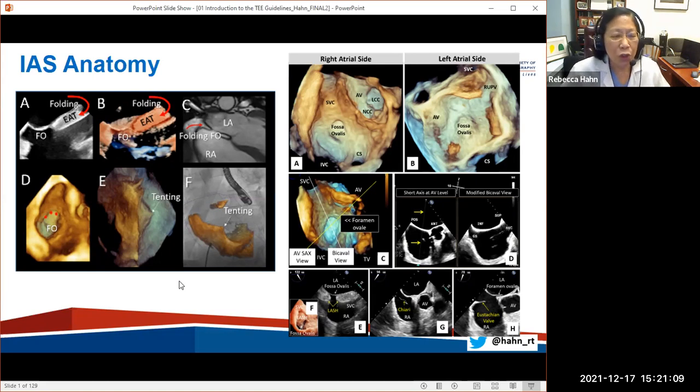often they are not. And so when you do a transseptal through the lipomatous hypertrophy, you risk having gone out the right atrium into the fat, and then back into the left atrium through the left atrial wall, and you won't know it until you take the catheter out, because you're tamponading that space when the catheter's in, and when the catheter comes out, you're no longer tamponading the space. And so you'll end up seeing, and we've unfortunately done this before, you'll end up seeing tamponade rather quickly.